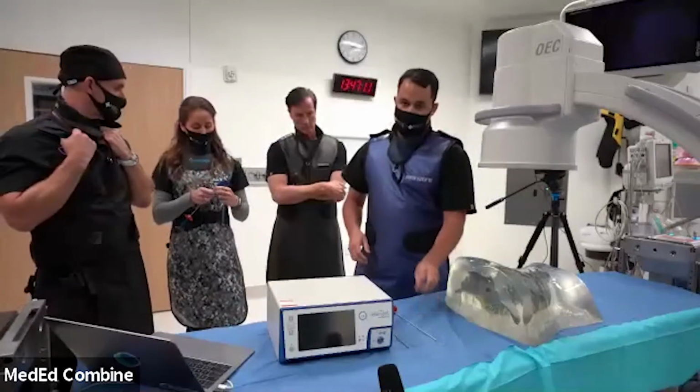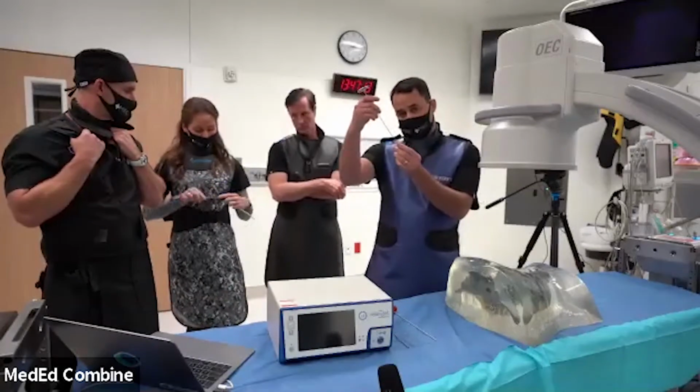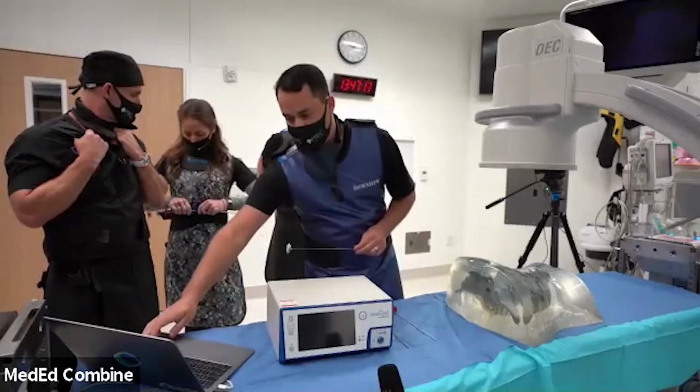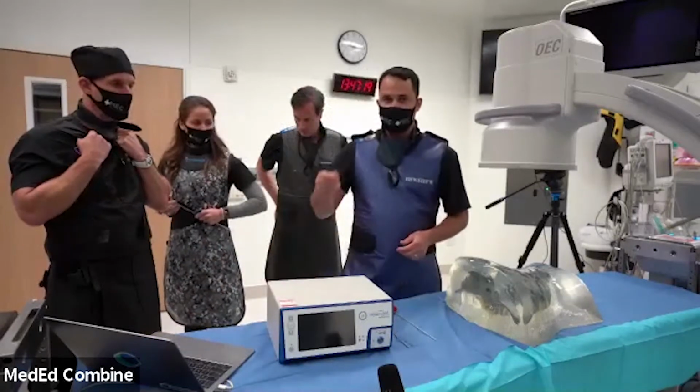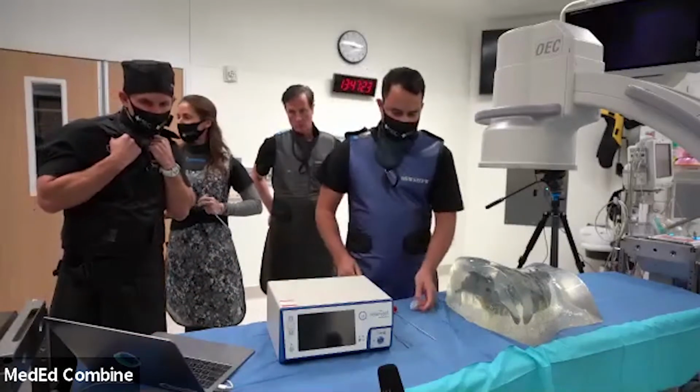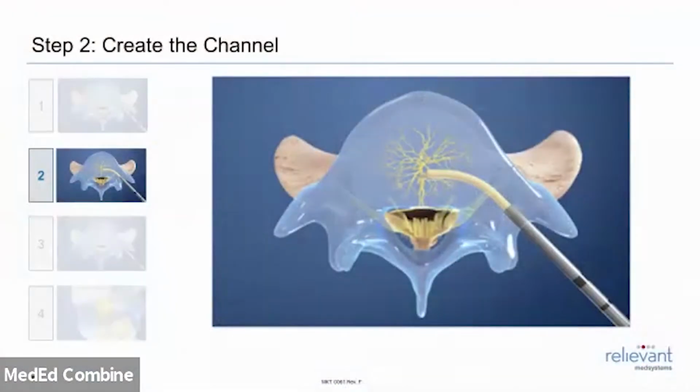But we get the curved in there. This is the cutting tool in the curved cannula. And what we do is after we get into the pedicle, we curve around right to where that basivertebral nerve is. We take this out. We put in the RF probe. And like I said, hook it up to the generator. You hand it off to Emily, or my rep is Aubrey or Paul. You hand it off to them, they do the rest of it, and we're good to go.